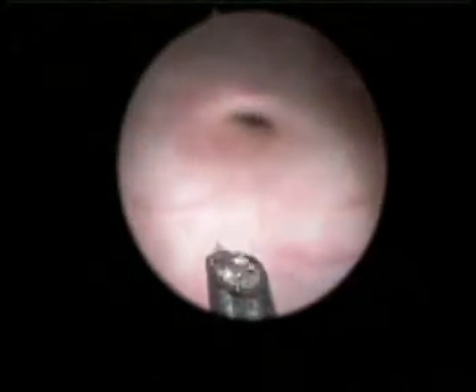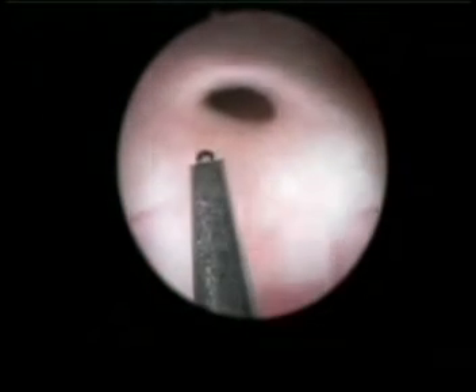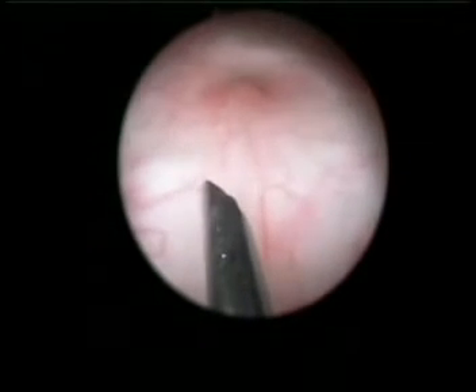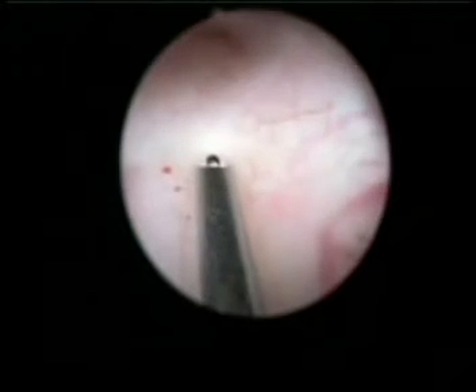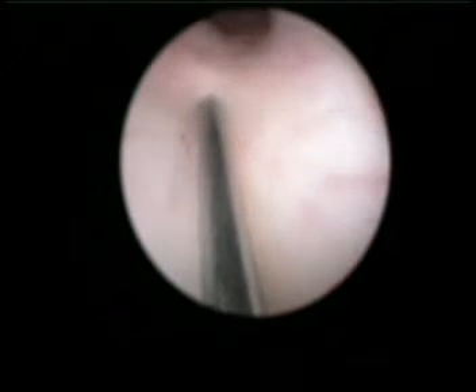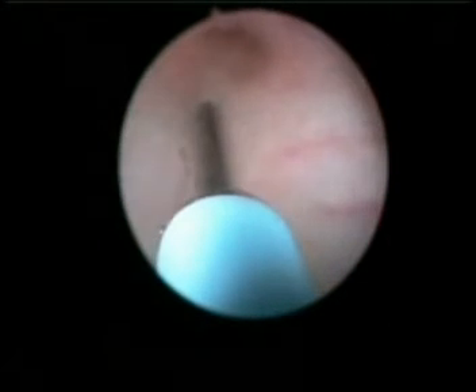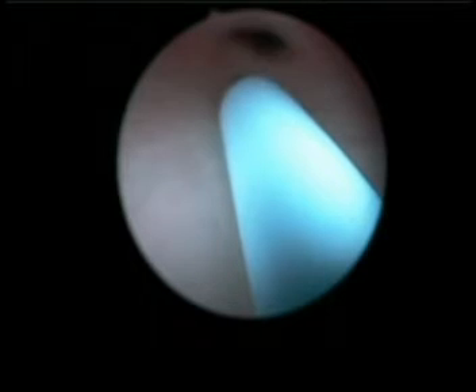Ensure that the eye of the needle is facing the ureteral orifice at a 6 o'clock position. The puncture should be done in the bladder submucosa, 3 mm below the ureteral meatus, at the 6 o'clock position, and reaching a 4 to 5 mm depth into the ureteral submucosa.